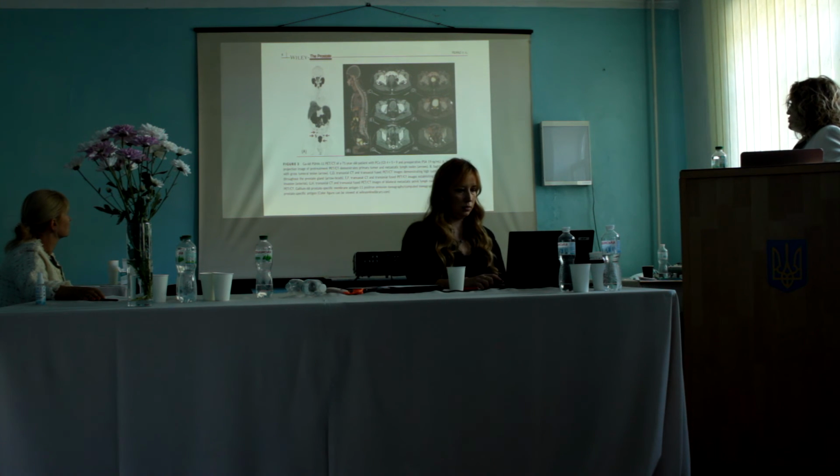This slide shows gallium-68 PSMA obtained in a 71-year-old man, pre-operative PSA 19 nanograms per milliliter. Maximum intensity projection images of pretreatment PET CT demonstrate the primary tumor and metastatic lymph nodes. Sagittal fusion PET CT images show a gross tumoral lesion and many metastatic lymph nodes in the pelvic region.